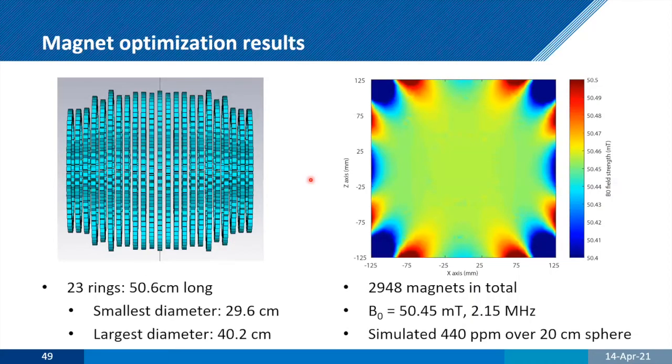So here's the system that he came up with. Effectively a side view here. We're looking at a pediatric brain in terms of being able to image. We have almost 3,000 magnets here and a magnetic field of about 50 millitesla. So we're operating at 2 megahertz. It's kind of interesting, it also came from a lab that used to do a lot of ultrasound, and this is exactly the frequency that they're operating at. Obviously, mechanical waves rather than electromagnetic waves.